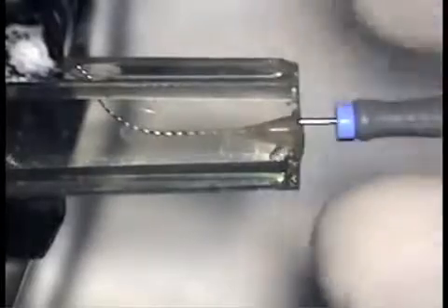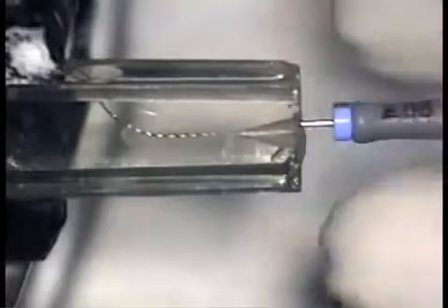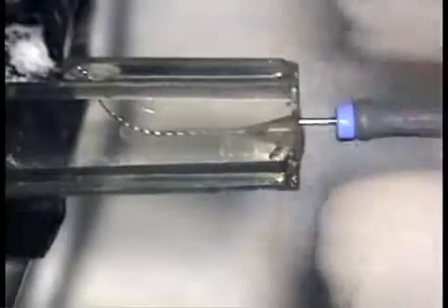We will be taking the instruments through a 25 approximately 1 millimeter beyond the length of the canal. This is the equivalent of taking the instruments 1 millimeter beyond the constriction of an intact tooth. Doing this prevents the buildup of debris at the constriction if we had gone short. This is completely in line with endodontic principles that are taught throughout the country.